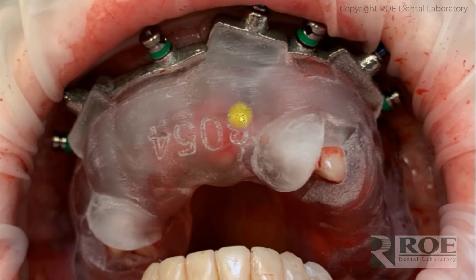So the first thing the doctor does is seat the pin guide, and sometimes that causes a little discomfort, so you may anesthetize the patient first. That's usually the case. And then you seat it, and then you view on these windows to make sure the pin guide is seated. And as long as it is fully seated, then it's removed, and then it is attached to the fixation base using the chrome locks.